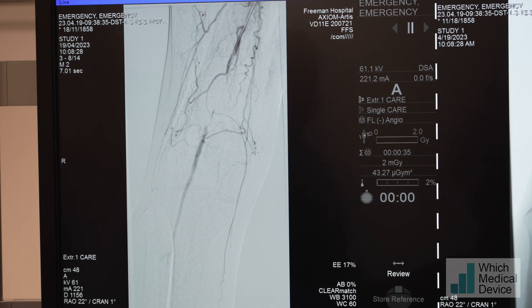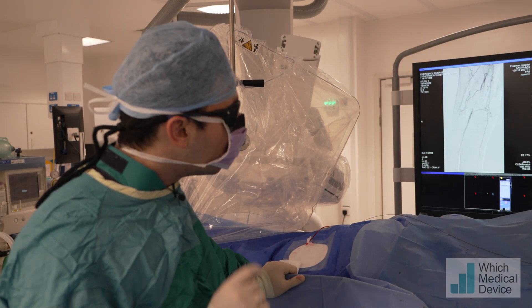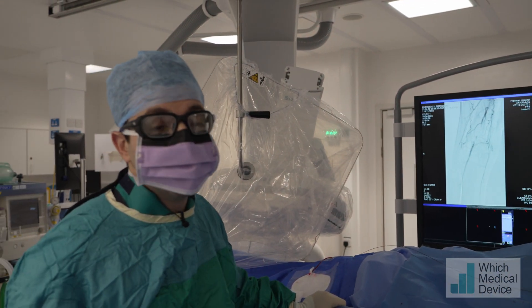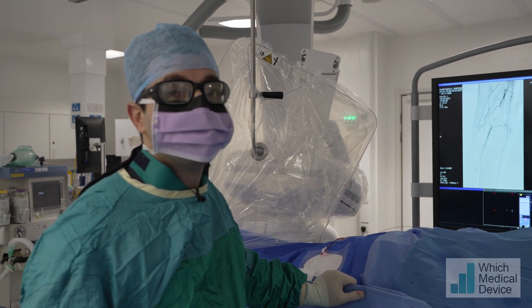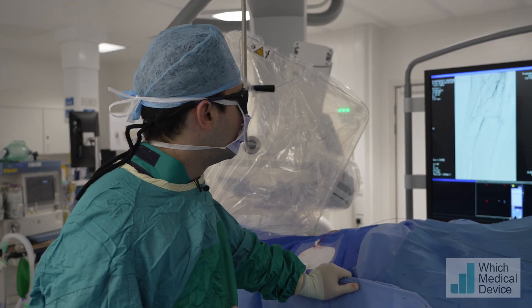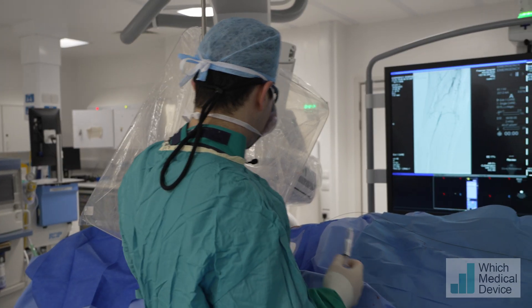So how are you thinking you might cross this? We'll need to use an angled catheter to direct the wire, and we can probably try it very gently using the back end of a J - so a straight wire, or even a Benson. You may actually manage this with a straight wire and straight catheter or the angioplasty balloon without using an angled catheter as well. I'll do the completion imaging just to make sure.